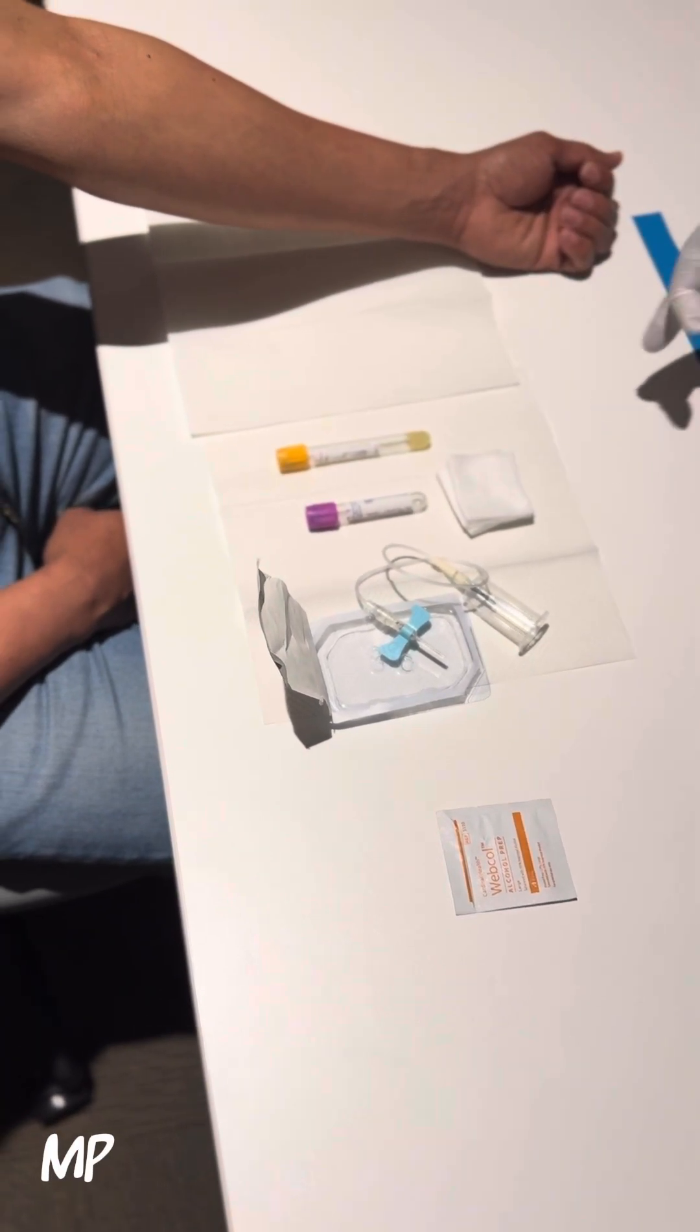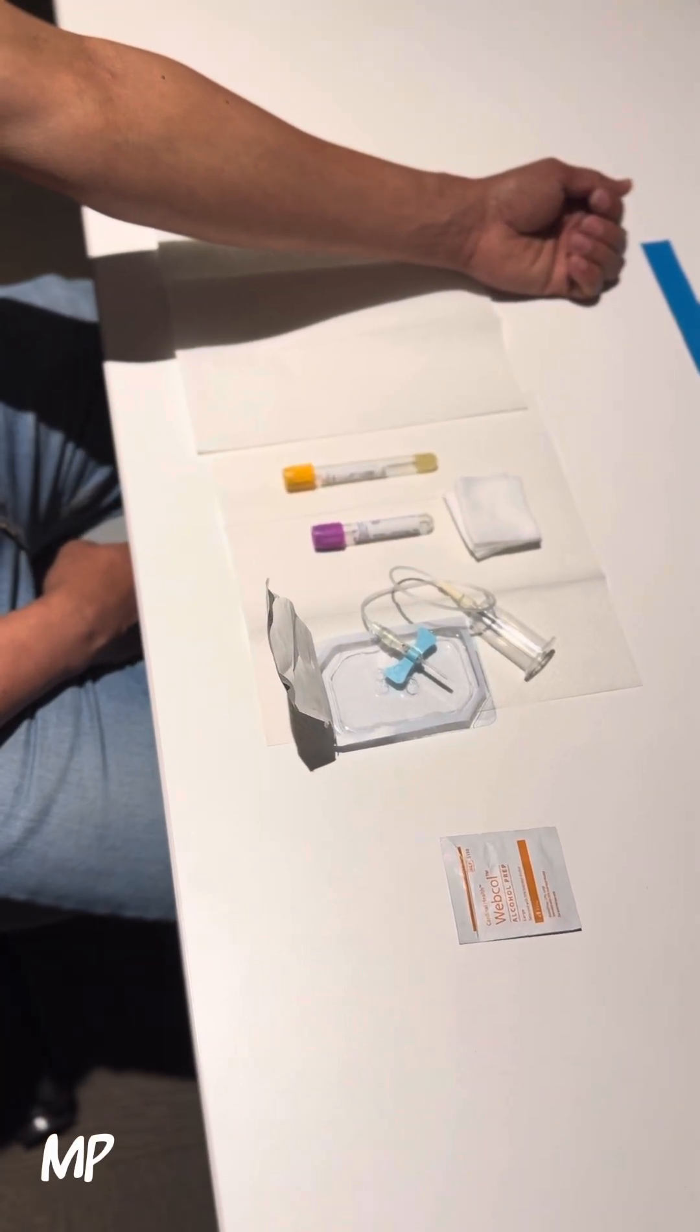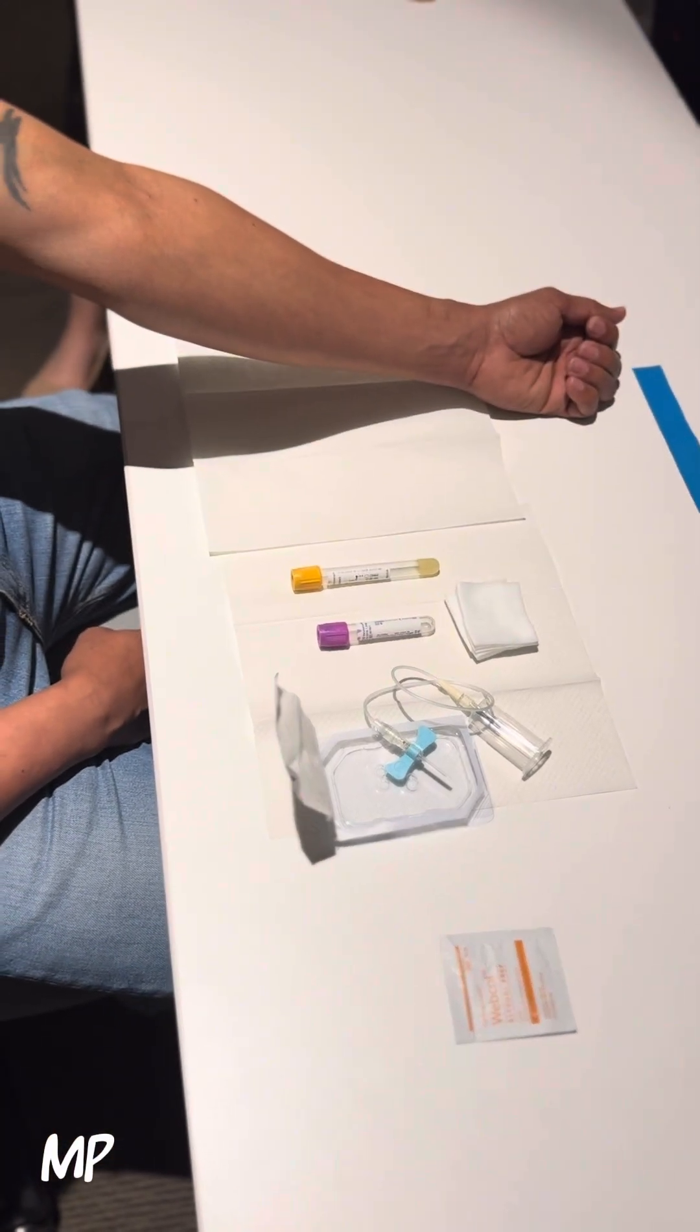We're going to use the correct order of draw sequence. SST tube first for chemistry, then our lavender EDTA second.